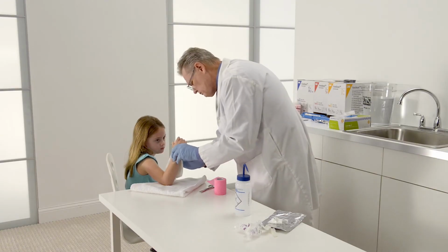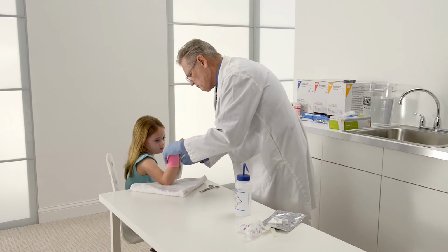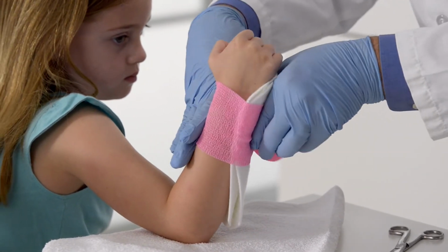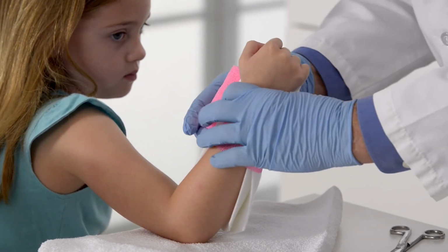Once your splint is wet and excess water has been removed, apply the splint starting at the distal palmar crease, allowing it to follow the natural contours of the forearm.